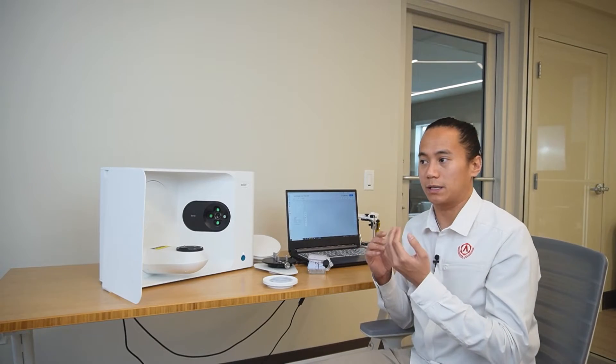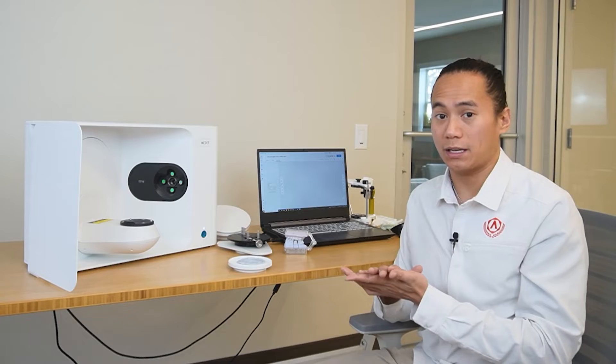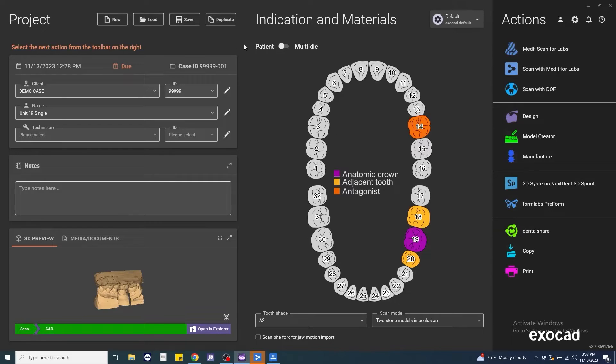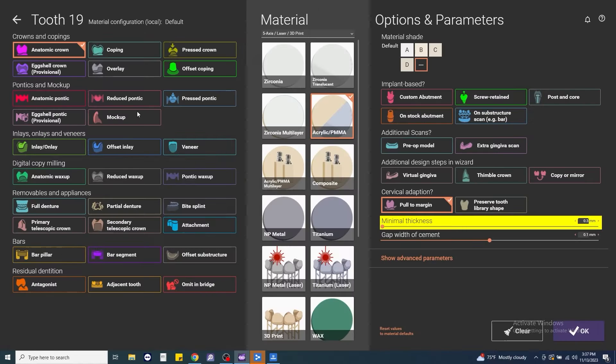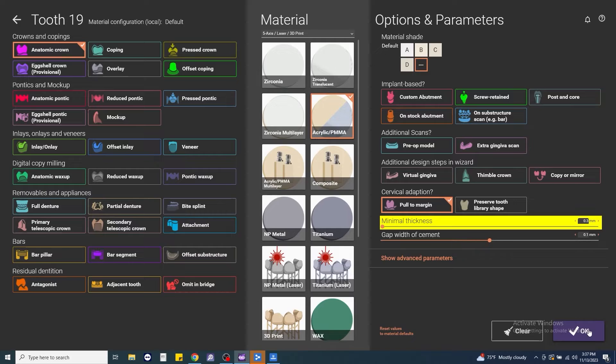Now, depending on whether you're going to be just scanning in Medit and sending those files out, having somebody else design your cases, you can set everything up in the Medit Link application. But if we are going to design in ExoCAD in-house, what we're going to do is set up the case in ExoCAD first. I've already set the case up in ExoCAD as a single unit crown. We're going to be working on number 19. Again, standard anatomic crown. We're going to be milling this in PMMA. And we're leaving all of the parameters here at default because we're not doing any implant-based restorations right now. We don't have a pre-op scan. We don't want to do a virtual gingiva. And we're pulling our crown to our margin line. So from there, we'll click OK.